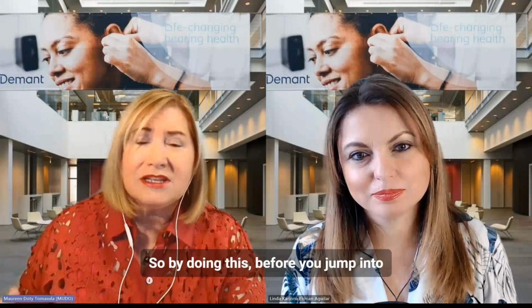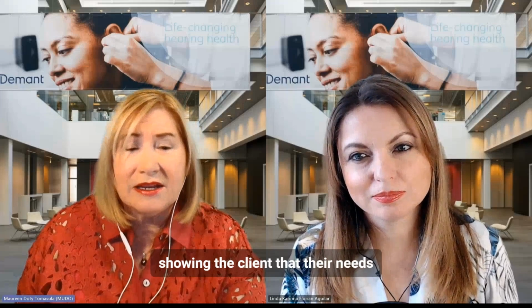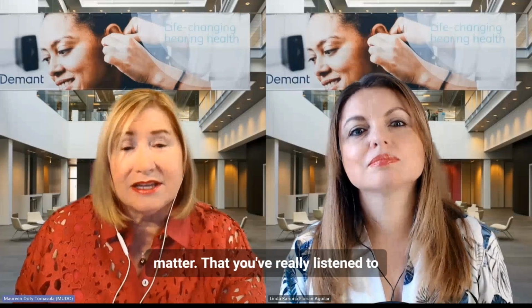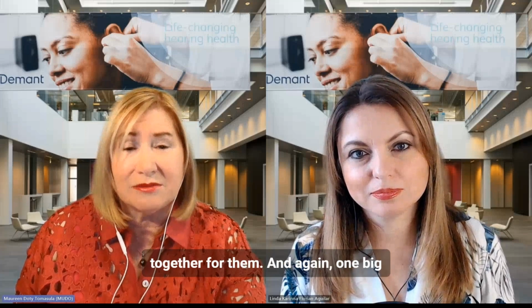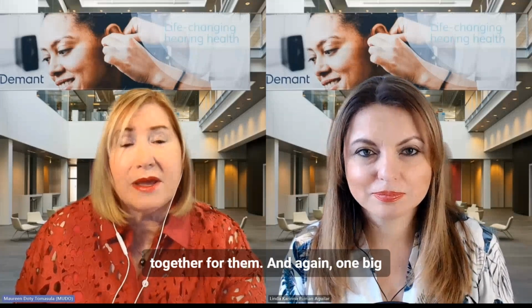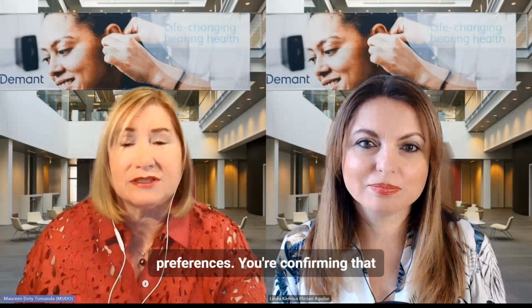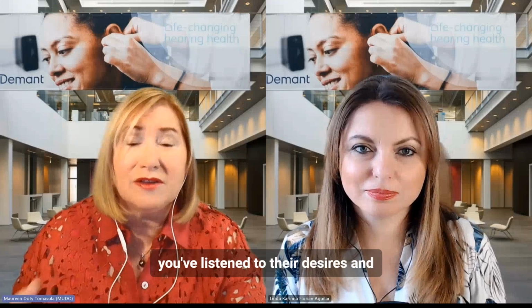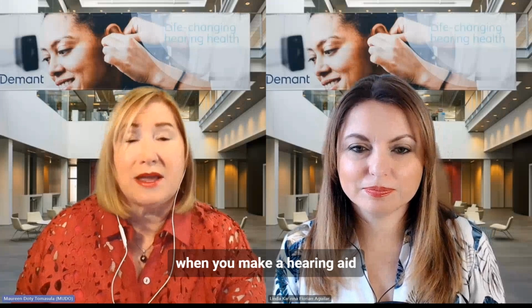So by doing this before you jump into the hearing aid recommendation, you're showing the client that their needs matter, that you've really listened to them, and you're helping to put it all together for them. And again, one big benefit of this tool is that you're validating the client's needs and preferences. You're confirming that you've listened to their desires and you're taking them into consideration when you make a hearing aid recommendation.